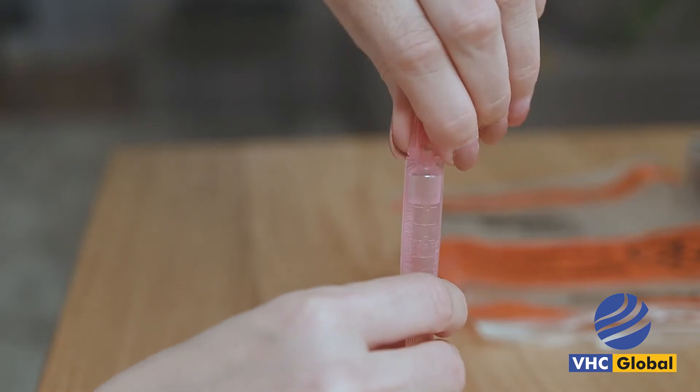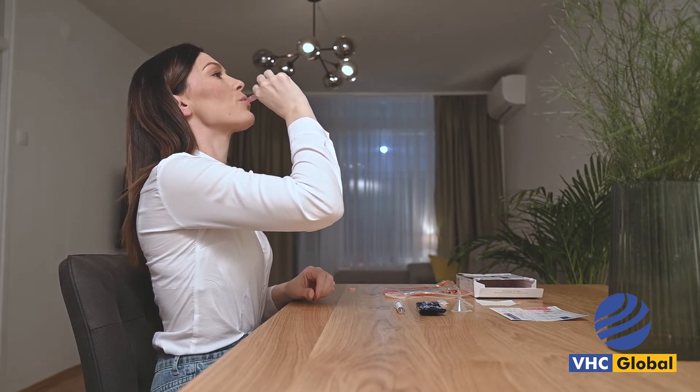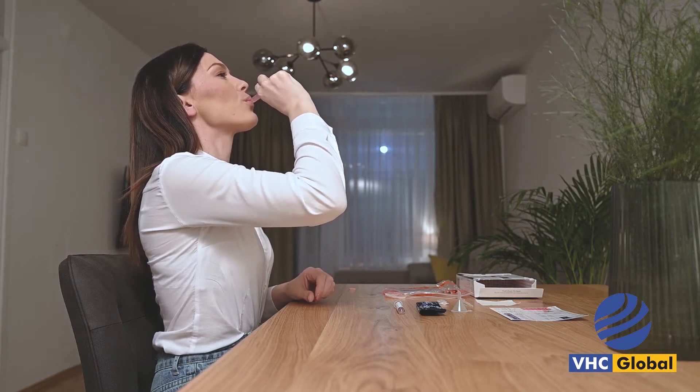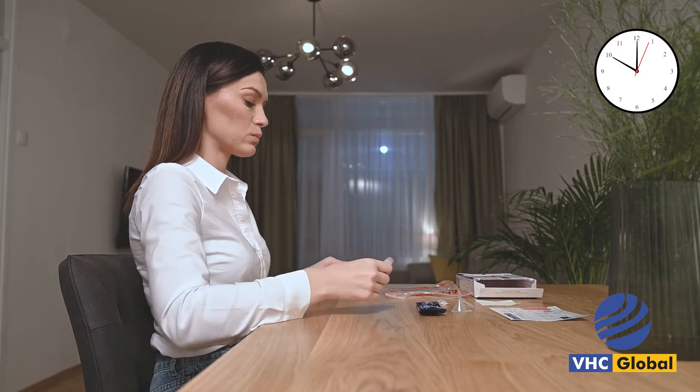Tear off the top of the saline solution tube. Empty the contents — 5 milliliters — directly into your mouth. Swish like you are using mouthwash for 25 seconds, followed by a gargle.